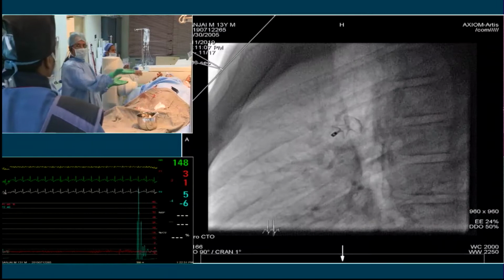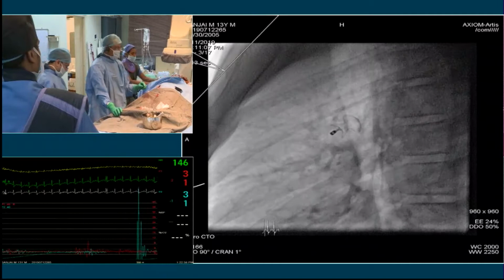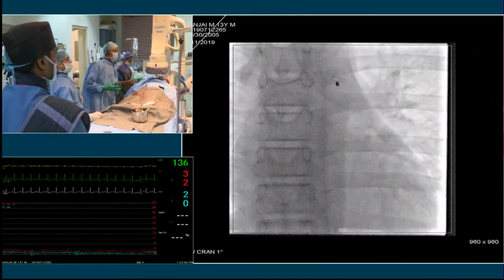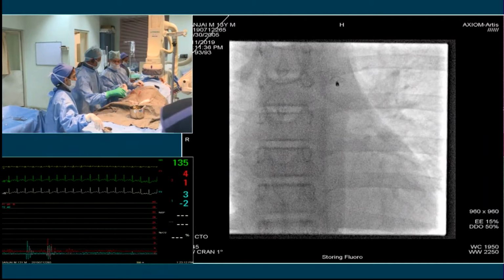I don't think there'll be a formation of any thrombus on the arterial side, even with a big ampulla. Opinion? Anybody agree with that? I have a different opinion. The larger the device you use, it will deform the aortic arch, and it can even produce aortic regurgitation. So the smaller the device, always the better.